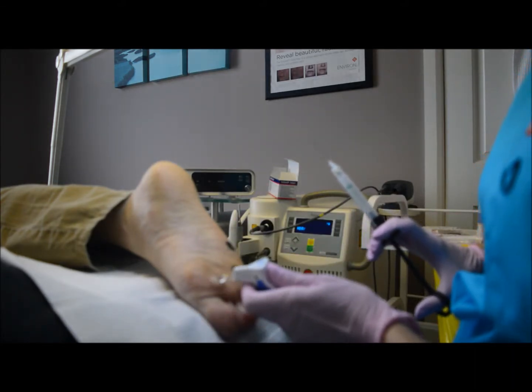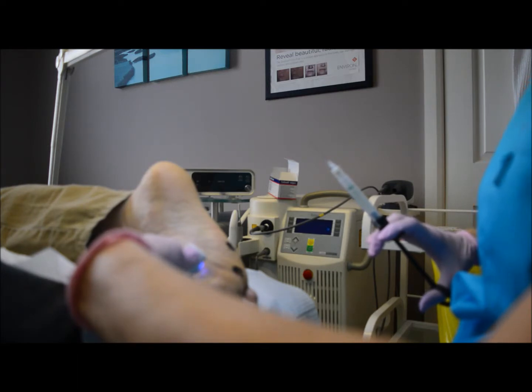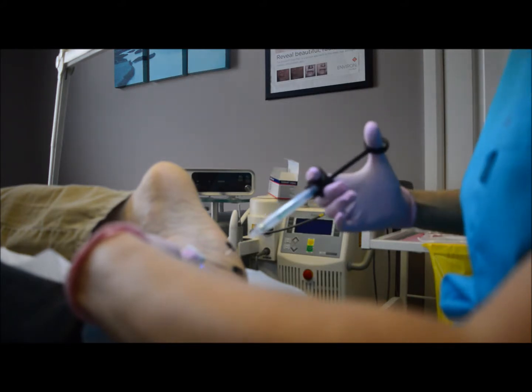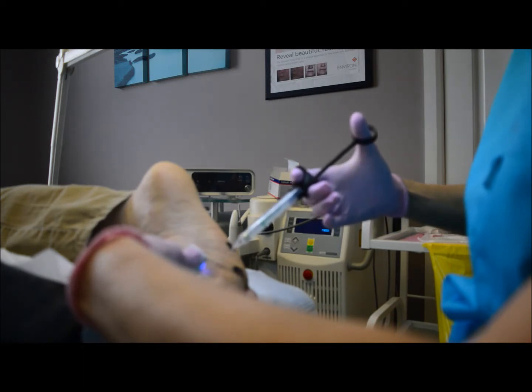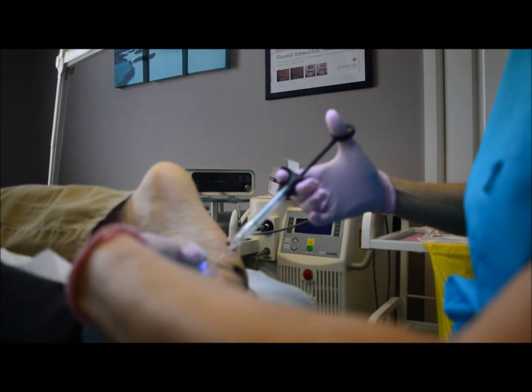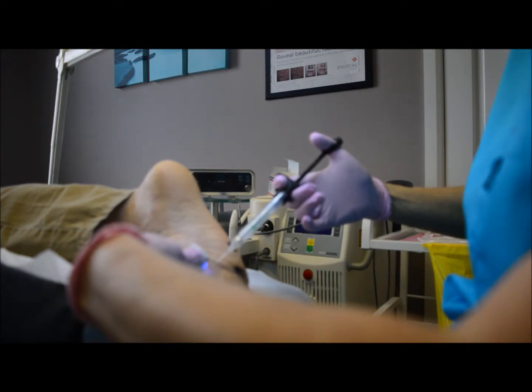What we do is just place the device over the area that we want to anesthetize and have it going for a little bit of time — this will start to disturb and interrupt the nerve pathways. I'm now going to infiltrate this area. My patient is allowed to give feedback. It's still going to be uncomfortable, but using this device we can get analgesia in. As you can see, I've gone quite a way in — are you okay up there? Yeah, it's tolerable.